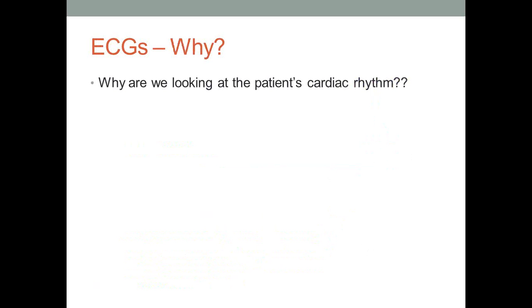So why are we looking at ECGs? Think about a patient who's complaining of chest pain. Why are we interested? Why do we want to see what their heart rate is? Will it determine our treatment plan? So there's an adage out in the field that you'll hear, probably from preceptors or maybe medics working in the lab, that you never treat the monitor. Well, that's sort of half true. So our monitor is a tool that helps guide us in a certain direction. It doesn't replace our own clinical judgment. It goes hand in hand with it.